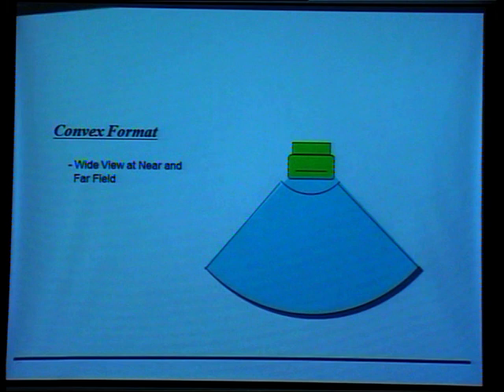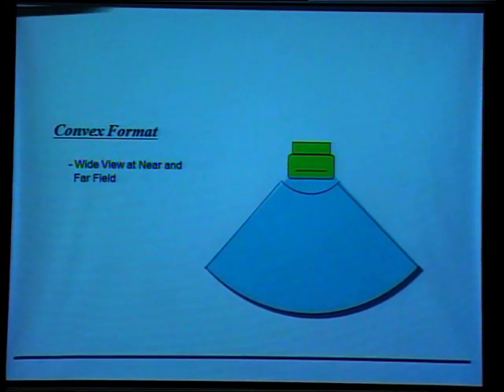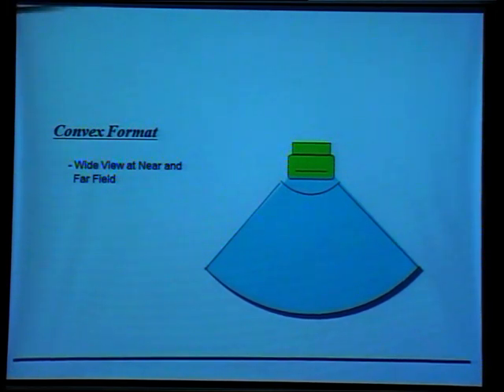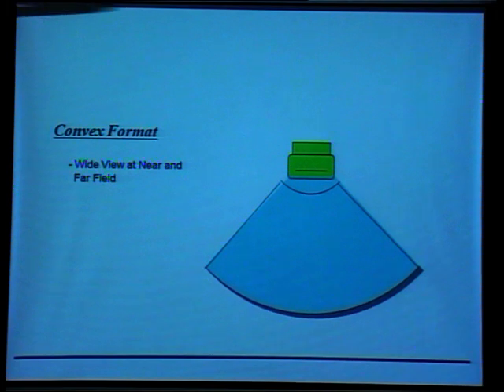We use it extensively in the first trimester, second trimester, third trimester. In case of pregnancy, we need to do the follow-up ultrasound as well. We call them second level, third level, and tertiary level of ultrasound these days.